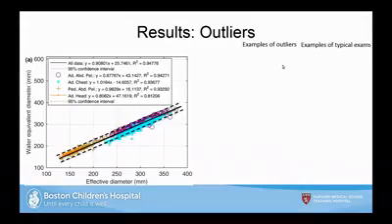Okay, so first thing we did was we wanted to validate the AAPM report 220. So here I'm showing the water equivalent diameter as a function of effective diameter, and as you can see, when I plot every point on there, this is for every patient, the results correlate quite well with each other. You can see the chest data is here, and the abdomen, and the pediatric and the head are down here.